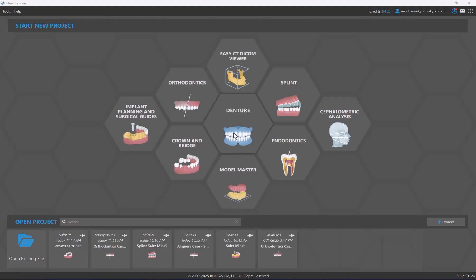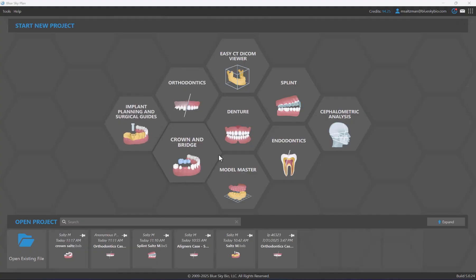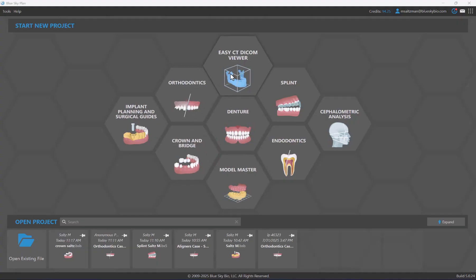We'll take a look at the other two screens as well: one that allows us to associate the case with a particular patient and the treatment they've come into your office for, and the third screen, which is the data import screen. First and foremost, we have the main part of the screen to start new projects.